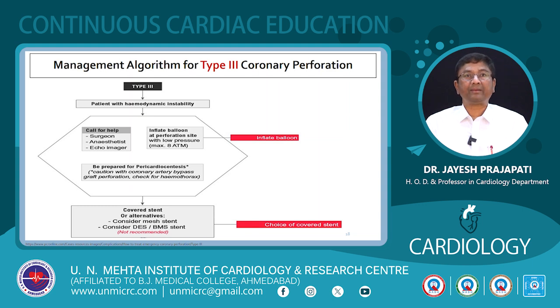Always, after post-dilatation, check with a shoot whether there is perforation, particularly when the balloon ruptures or something like that. Keep the balloon inflated and think about what is to be done, whether a covered stent is available or not, or some other technique you want to try, you want to tap meanwhile. So always keep the balloon inflated at nominal pressure. Nowadays there are some perfusion balloons available, like the Ringer balloon, which allow perfusion, and around 80% of the time keeping the balloon inflated works, but we have to watch for thrombosis.